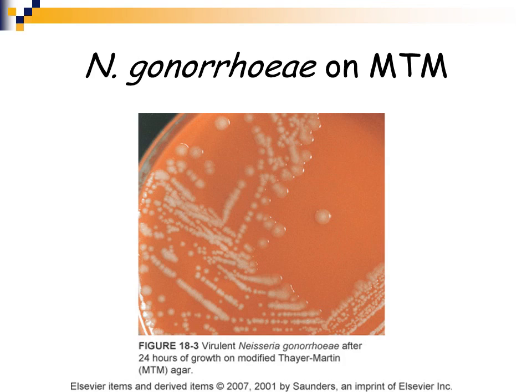In some labs you might use a blood agar, a chocolate agar, and a Thayer-Martin agar. In some labs you may just use blood and Thayer-Martin, so it's all going to depend. But if you're using chocolate and Thayer-Martin, or even just the Thayer-Martin, you need to make sure it's a Thayer-Martin and not a chocolate agar plate.